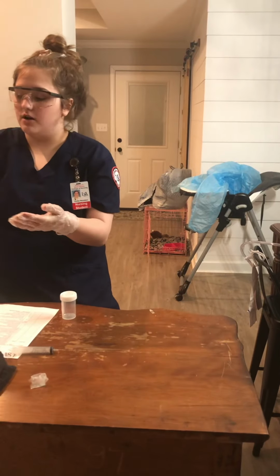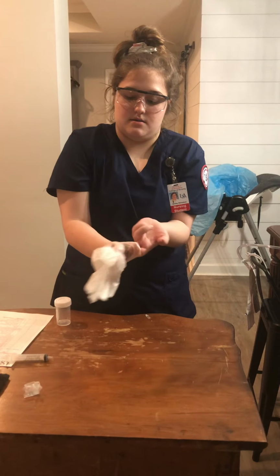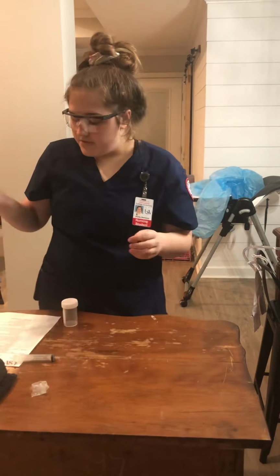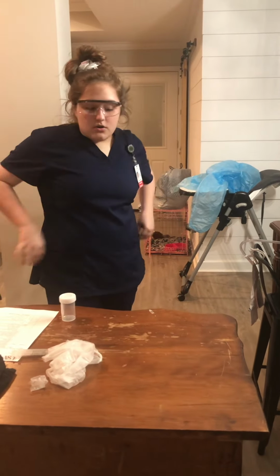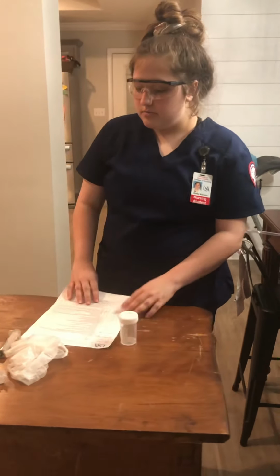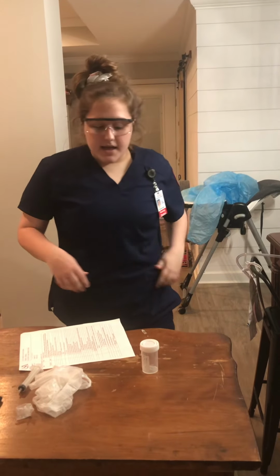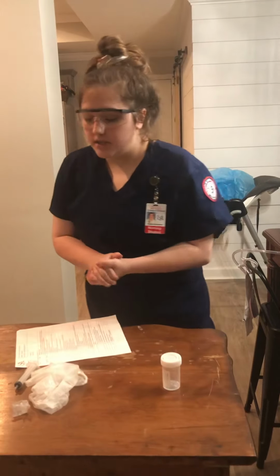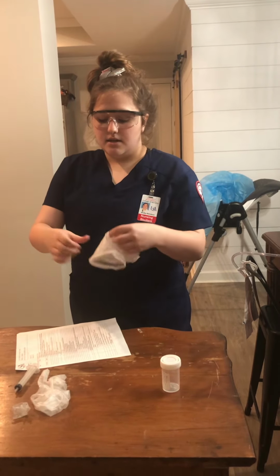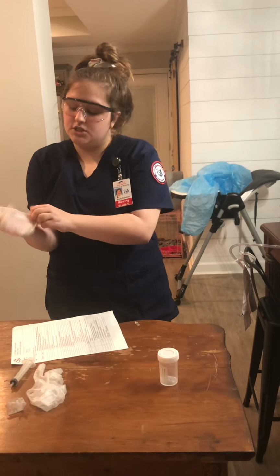And then I would remove my gloves correctly, like so, and then throw those away. And so now for discontinuing catheter, you're gonna want to verify the order just as you would do any other time, and then you're gonna want to perform hand hygiene, get some clean gloves. I'm just gonna reuse these as if they were clean gloves, just for the video's sake.